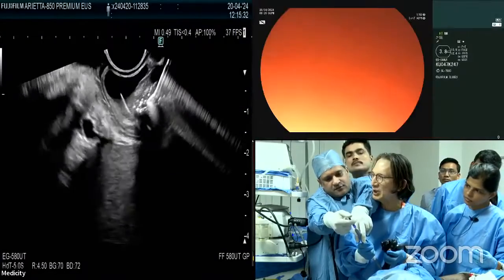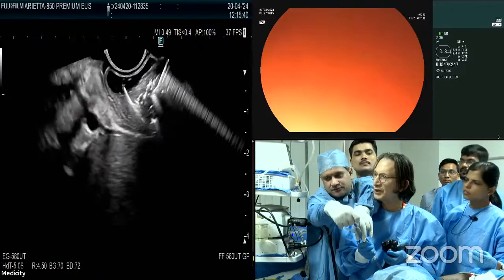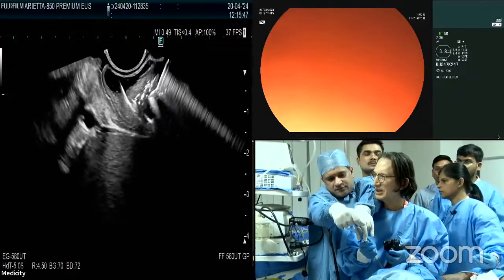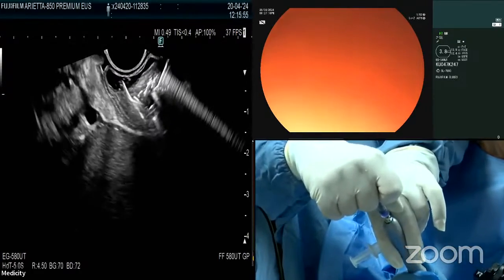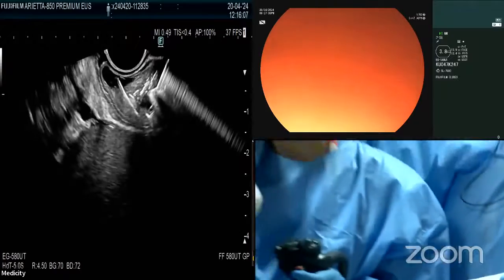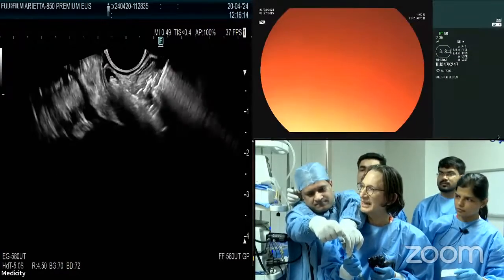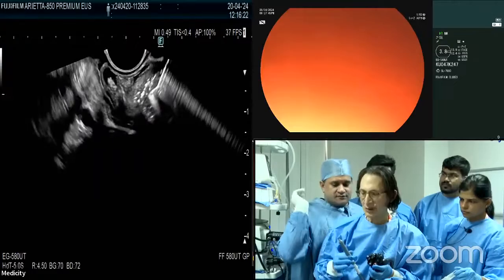Inject slowly over about 45 seconds — let it drip in. There are lots of coils in there so visibility is limited, but slowly push it in and it will first fill the dead space — about 1 cc fills mostly the dead space. Just hold your position; the idea is really to drip in the glue so it attaches to the coil. The glue we are using is 2-octyl cyanoacrylate — this is different from N-butyl. Now flush out the glue in the dead space into the varix very slowly. We want all of that glue to attach. Now that it's fully in, I pull back.